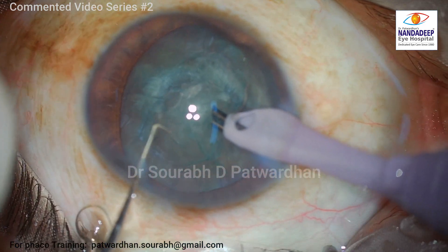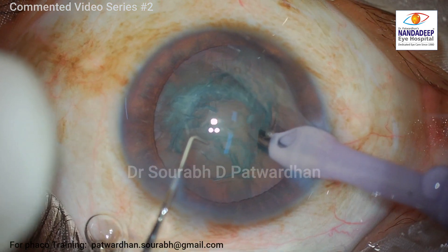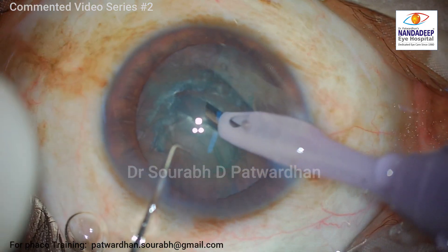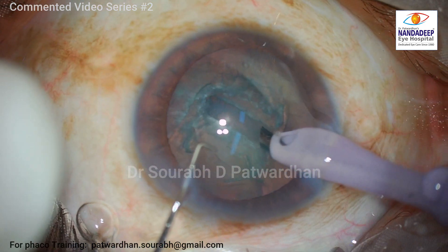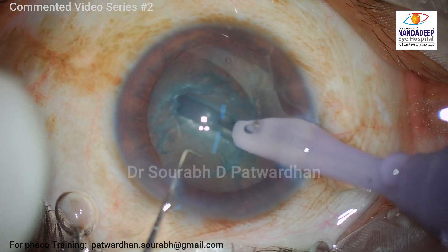What I noted here is that despite that block, the AC depth was not increased significantly. That may be because of the thinner lens — maybe the zonules are not that elastic.